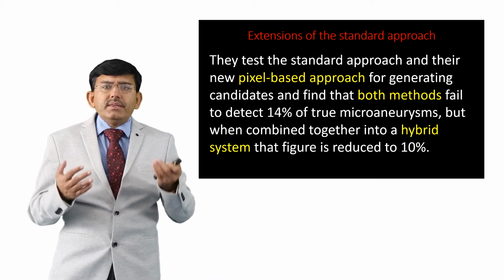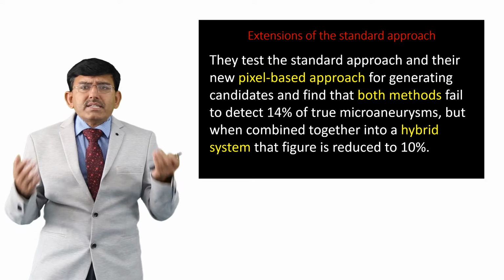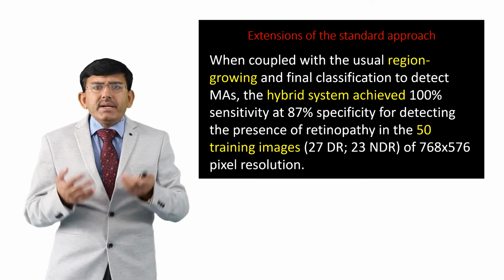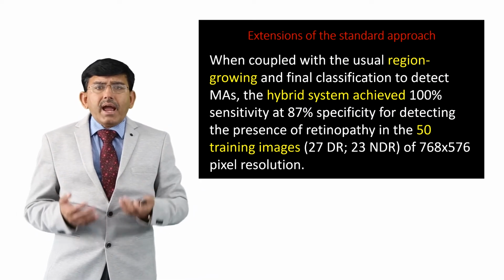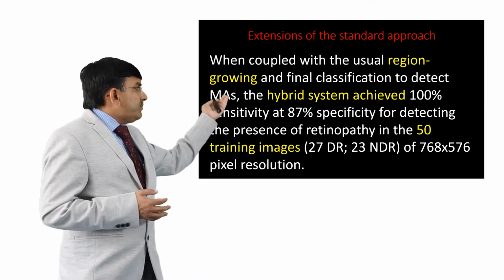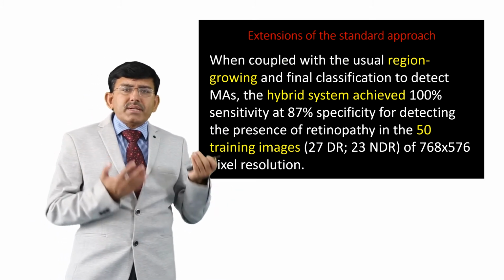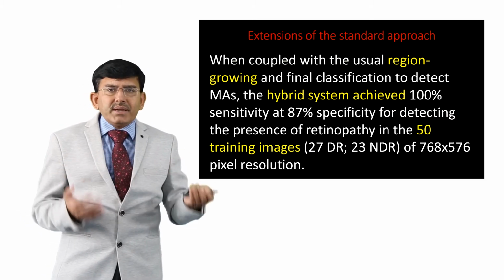When coupled with the usual region growing and final classification to detect microaneurysm, the hybrid system achieved 100% sensitivity at 87% specificity for detecting the presence of retinopathy in 50 training images.